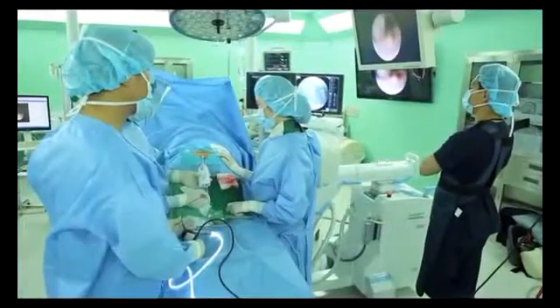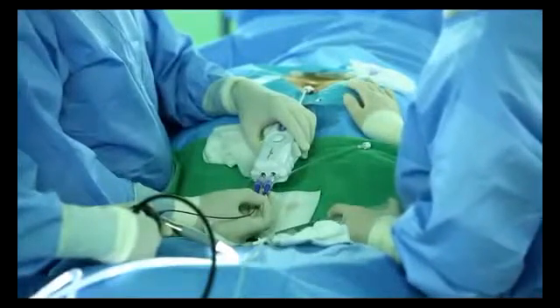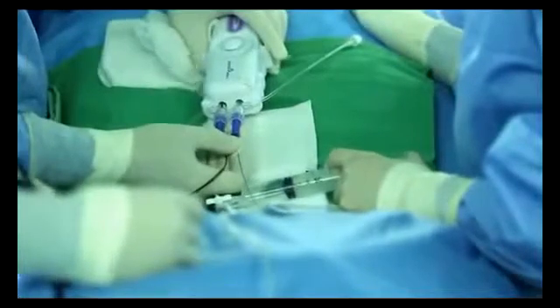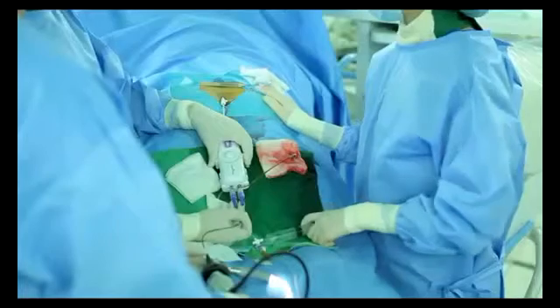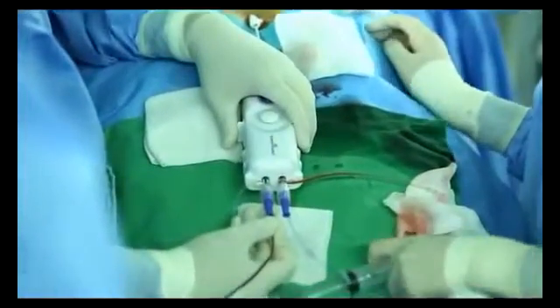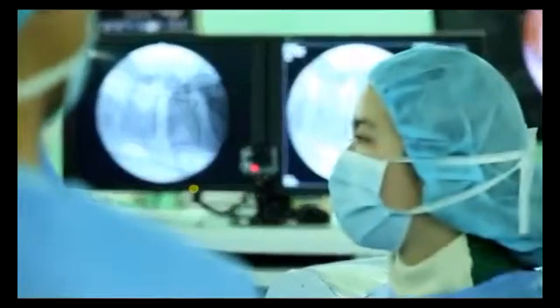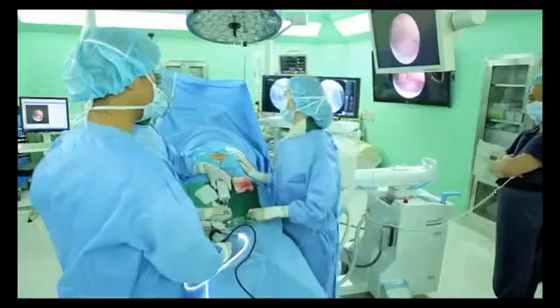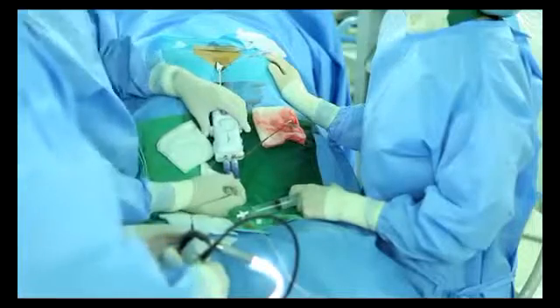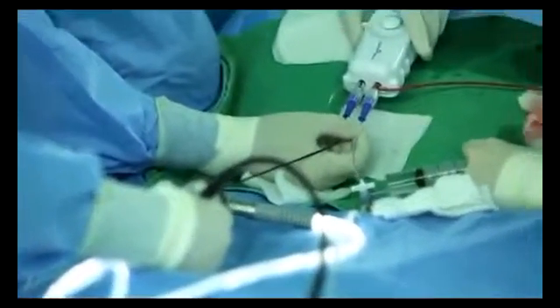While you are in the laser treatment, you keep injecting saline to see clearly. However, the patients appeal severe pain and want to stop this procedure. What can you do? SELD needs more or less 200 cc saline, but it may exceed 500 cc in doing multi-levels. You are requested to use the minimum saline to keep a proper level of view and cool down the heat from the laser ablation, which may damage the nerve. You should push 1 to 2 cc saline intermittently, checking for an unclean view because of bleeding or disc particles, and push 5 cc saline for adhesiolysis for catheter advancement.